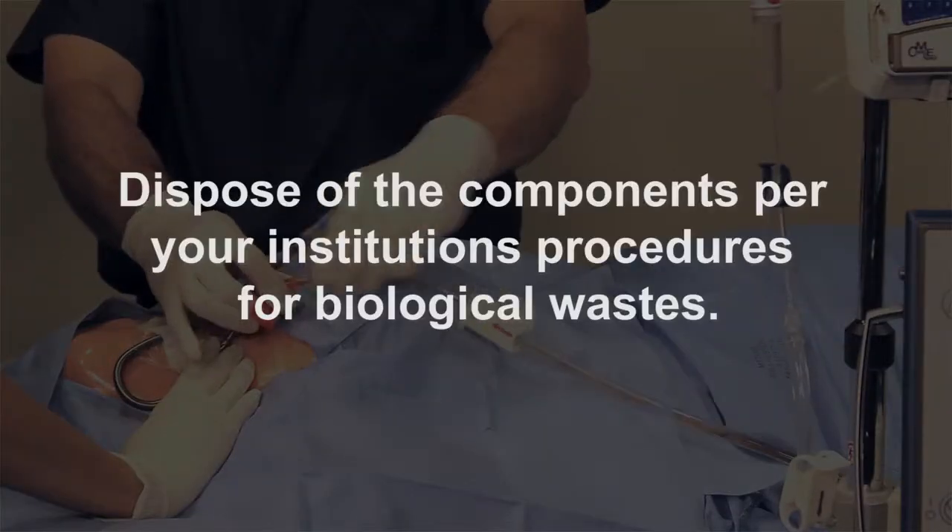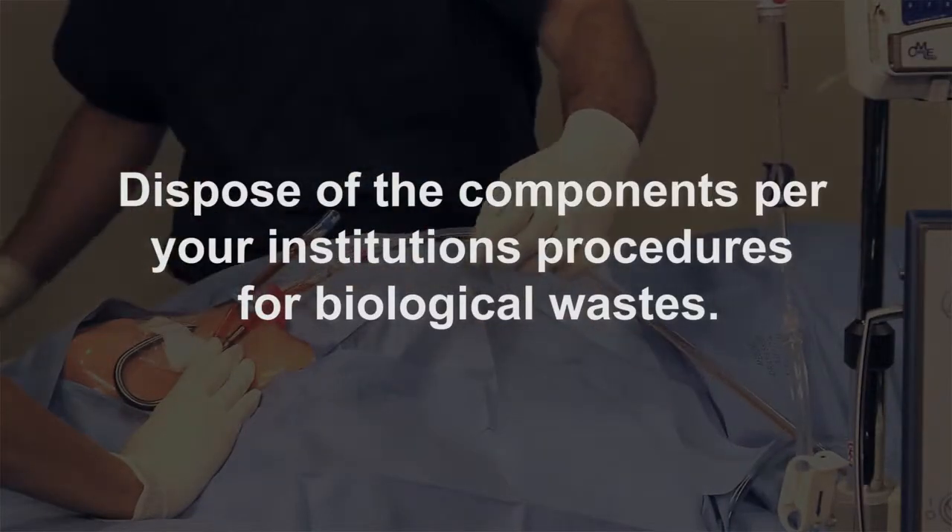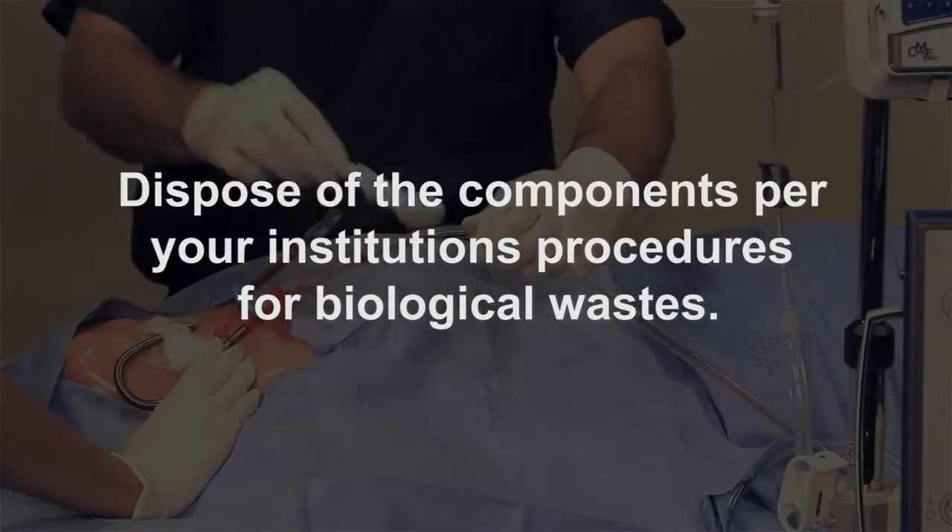Remove the catheter using standard clinical procedures for removing large-bore central venous catheters.